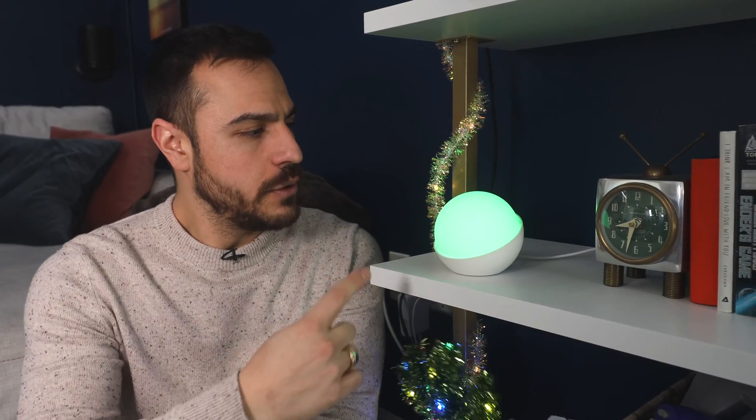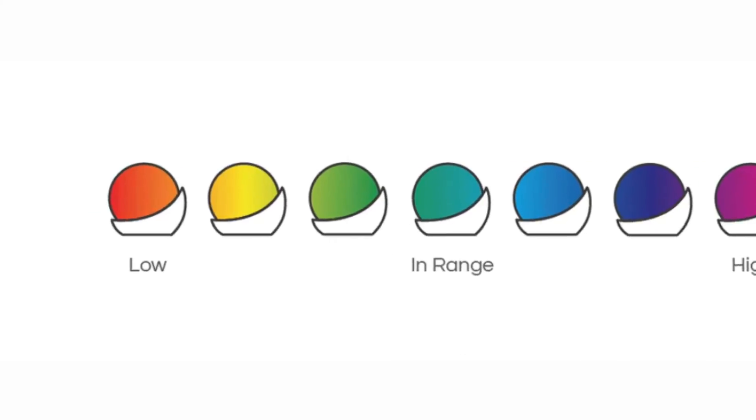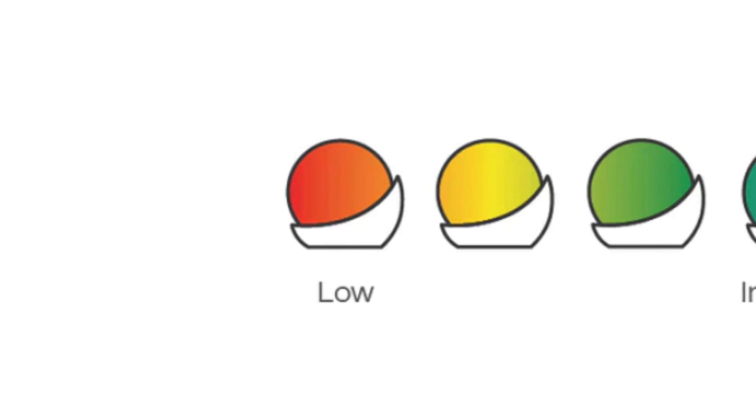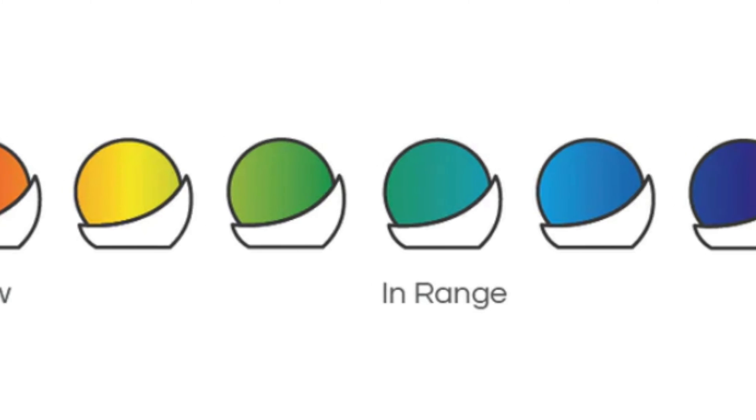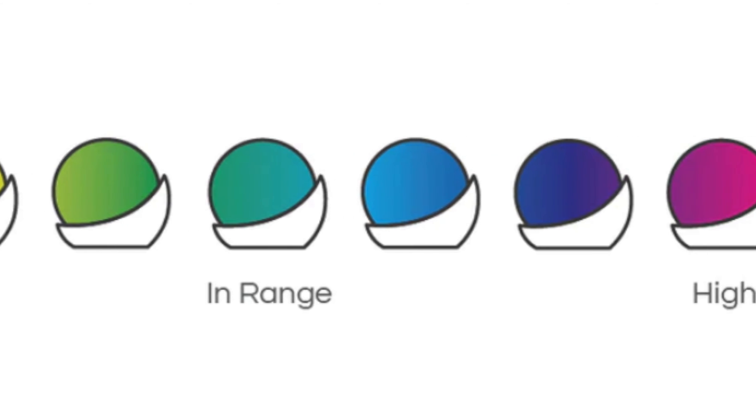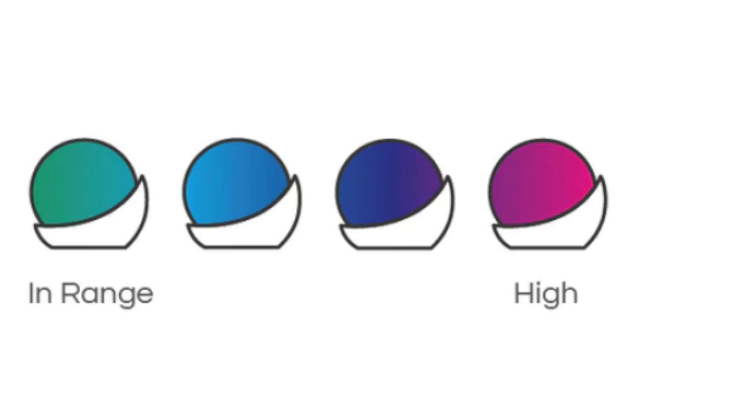This is Glowcoast. As you can see, it's a little bit different from the other things I've shown you because there are no numbers — there's only color. It glows, and right now you can see it's green because I am in range. This thing changes colors based off of your glucose readings. When you're really low, it goes to red, then orange, yellow, green for in range, blue, purple, pink for very high.